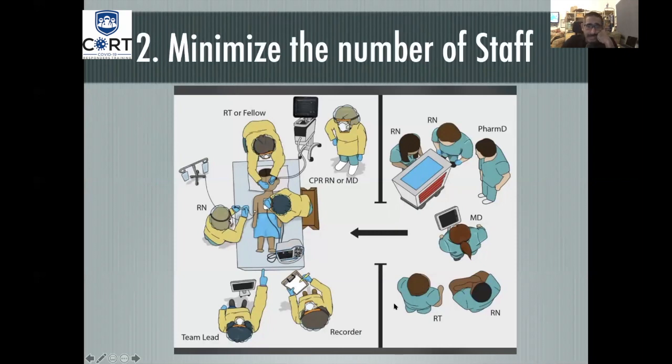If we go back to this diagram, where this nurse, the recorder, is already outside, and we apply the baby monitor, then these people are not needed anymore. We can put them outside because we don't need somebody to do the chest compression. Immediately when the patient is rushed in, or once we respond to the patient, any two of these three people go apply the Lucas, and then they go back to being airway, medication, and team leader. So now we've reduced people from six to three.